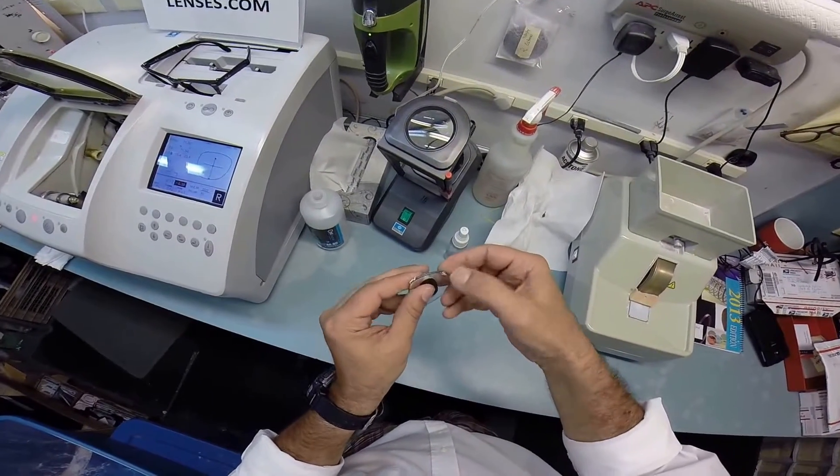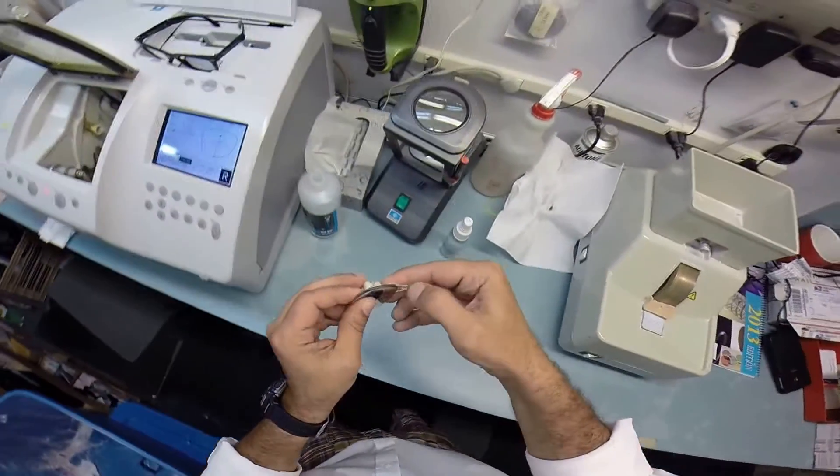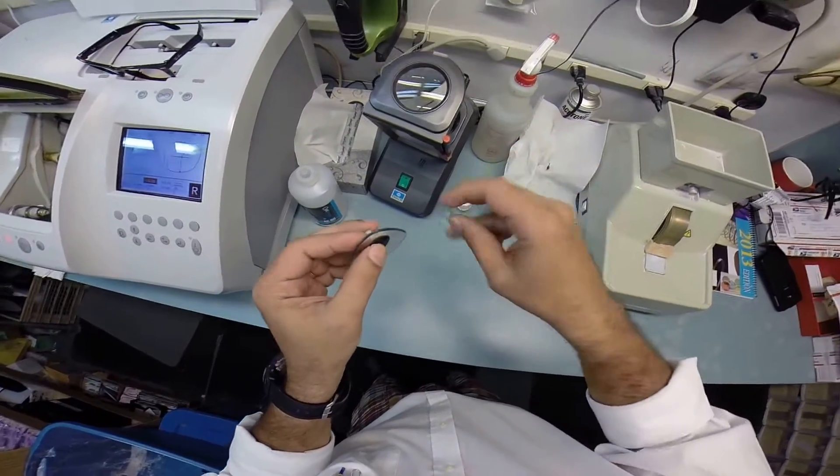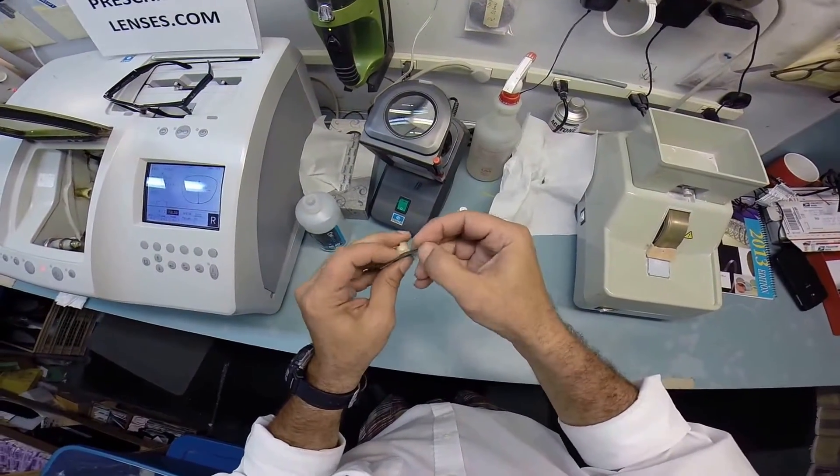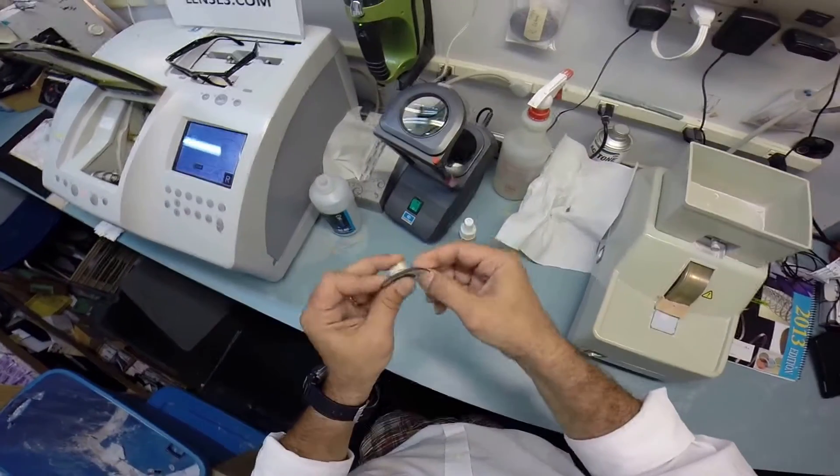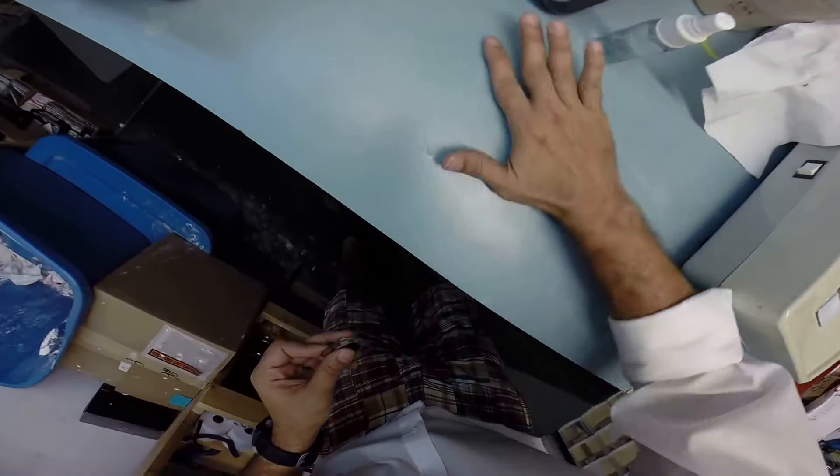This white powdery substance that you just never see in Florida and is on the edge of this lens is called schwarf. I use my thumbnail to scrape it off the edge of your lens. I do it so much I've worn a bevel into my thumbnail. Once it's all off of your lens and onto the counter, I carefully collect it into one pile and then I wipe it on the floor.